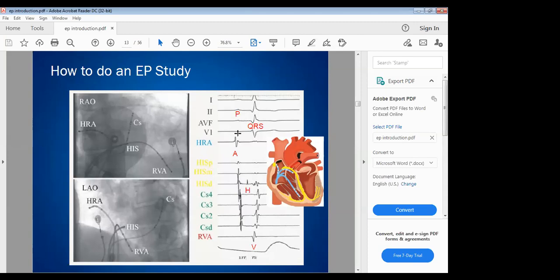Thank you, Chief. So now I'm sure you look at this wave and it looks bizarre, and you wonder what is the meaning of all these things. Don't worry, there's a simple way to know. At the EP lab, the patient will be on a surface ECG. So this is the surface ECG. And these are the catheters that are already in the patient: the right atrium, the His bundle, where P means proximal, mid segment, distal, as I explained, using these catheters.